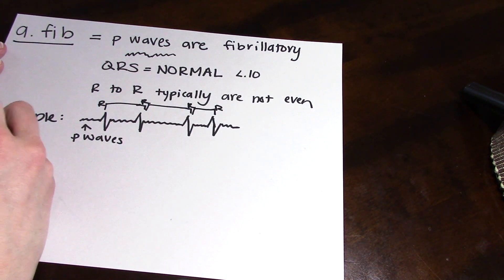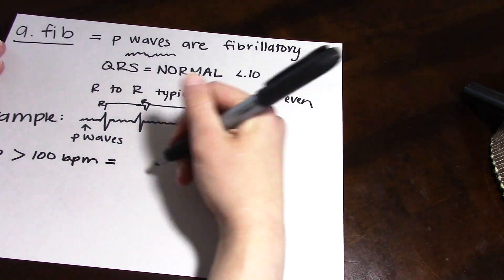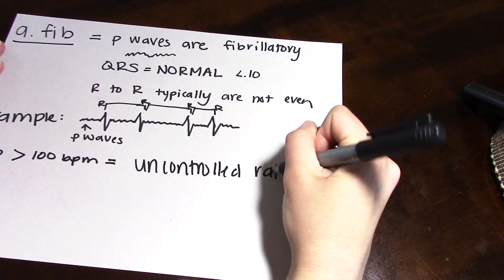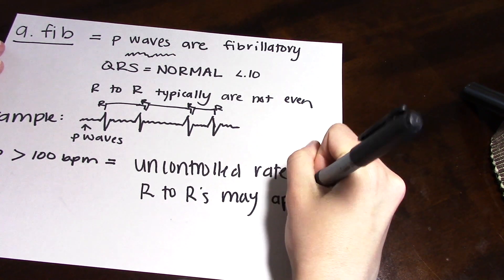I apologize that this next part is slightly cut off, but basically if your rate is above 100 beats per minute, then this is an uncontrolled afib rate. And if it is less than 100 beats per minute, then it is a controlled afib rate.